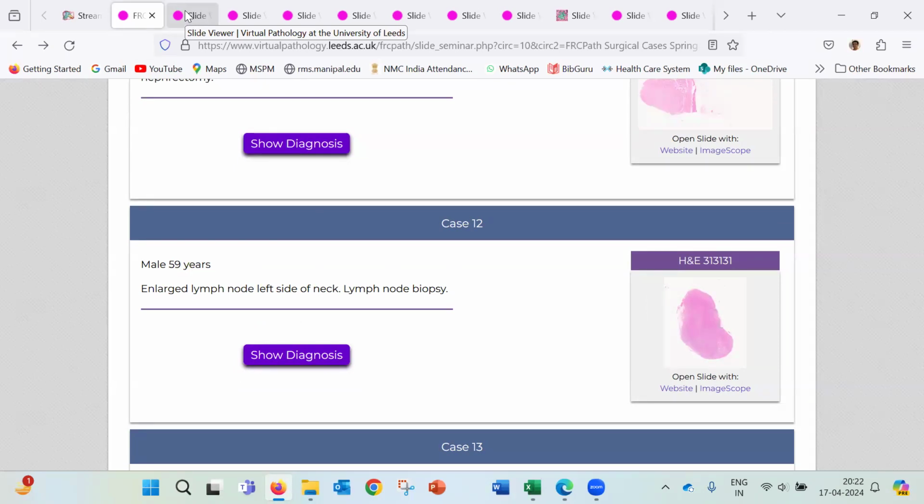I need to go back. I have not seen very many cases. So anybody who wants to add some points on how to differentiate? Because this pattern is quite characteristic of ganglioneuroma. The periampullary location, what I remember, is quite characteristic. They don't happen in other parts of the GI tract. So ampullary mass, they can have this kind of gangliocytic paraganglioma.